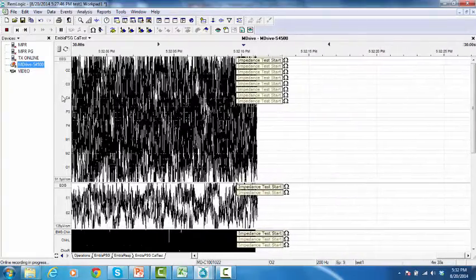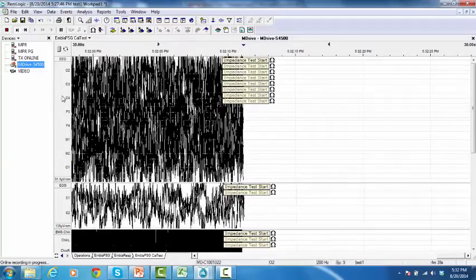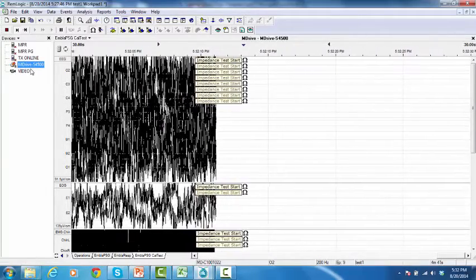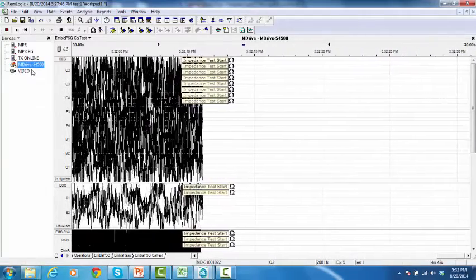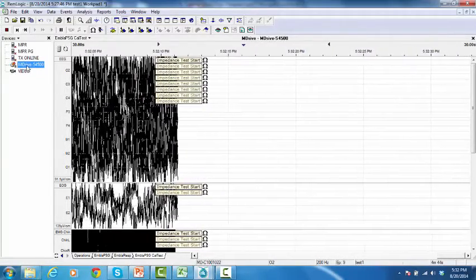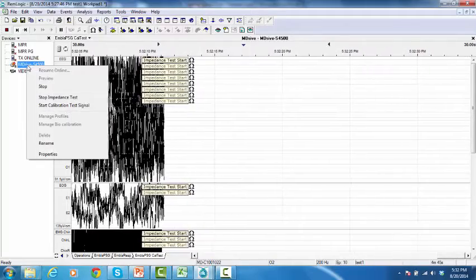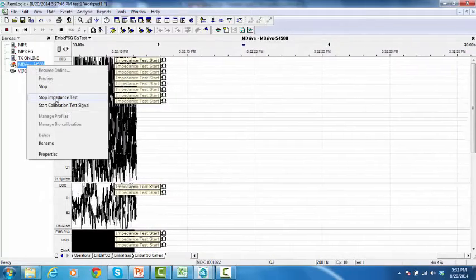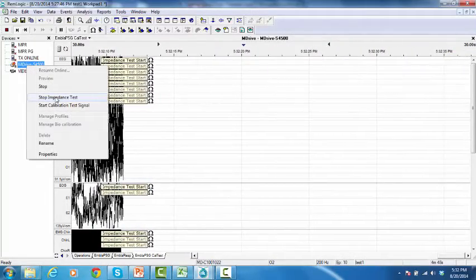To stop an impedance test, from the device manager, right-click on the M-Drive and click Stop Impedance Test.